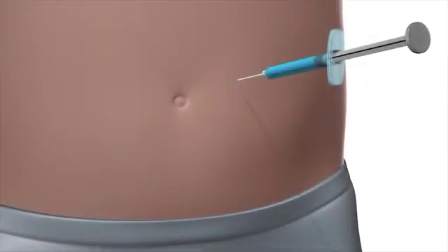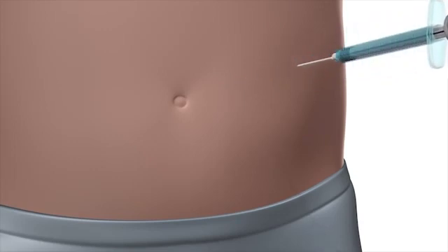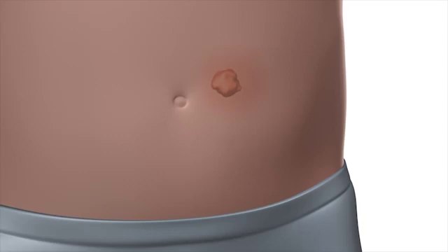If you use the same injection site over and over again, you may get hardened areas under your skin that keep the insulin from working properly. Rotating your injection sites will make your injections easier, safer, and more comfortable. Follow these guidelines. Ask your healthcare provider which sites you should use.